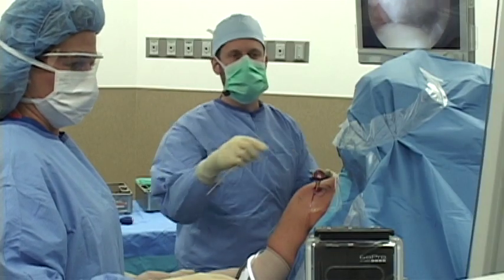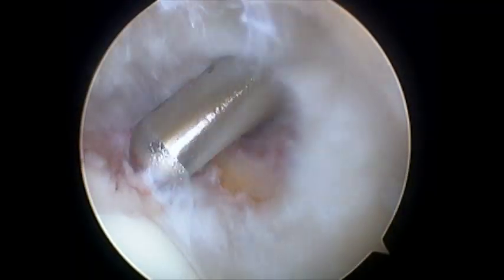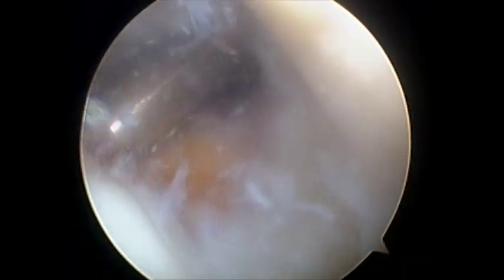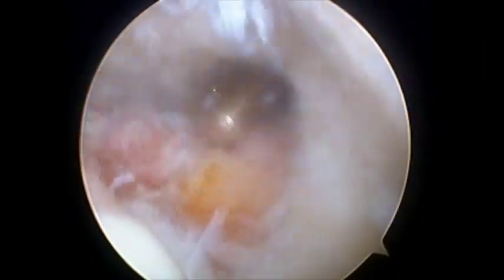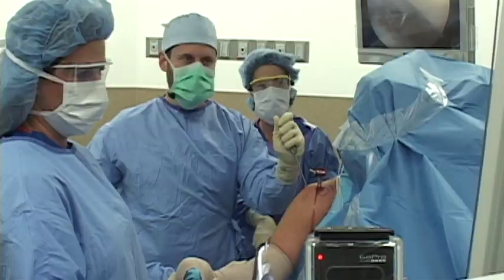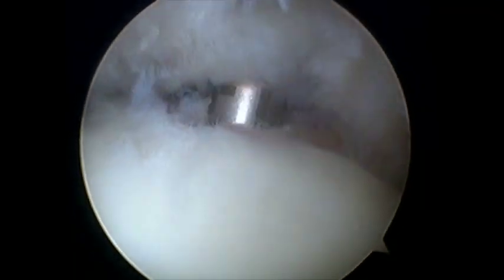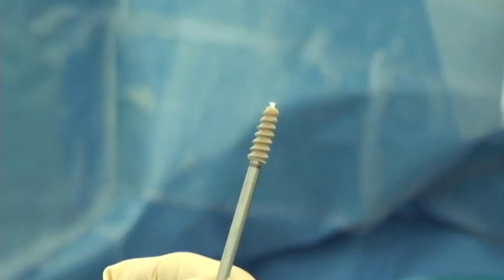I'll take a single 5-5 suture anchor and I'll take the shaver again. For the tendon to heal correctly, there needs to be a bleeding bone surface, so we're going to clean this up even more and allow a little bleeding to develop. Now we've got a little bit of bleeding there and raw bone surfaces for the tendon to heal to. Now we'll use a device called an awl to make a hole in the bone. I just gently tap a hole into the bone.